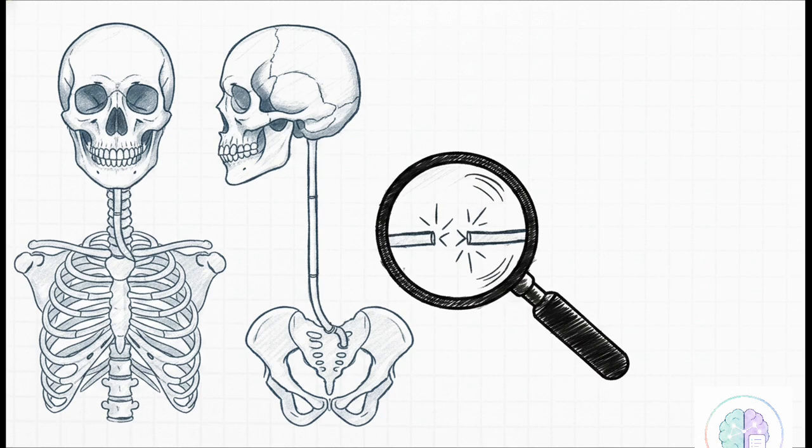And here's a clinical pearl you cannot skip. You must always pull the most recent previous X-rays to compare. Subtle breaks are super easy to miss, especially if you're dealing with a complicated system that has multiple ventricular or cyst ends or extra accessory hardware.